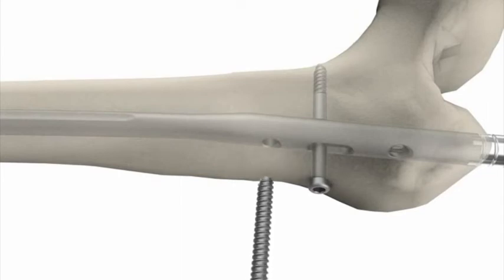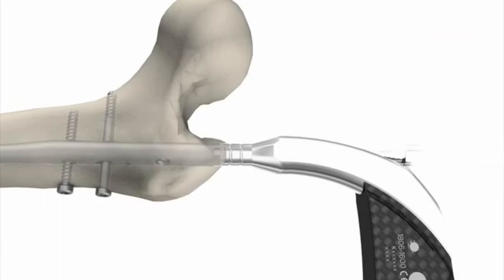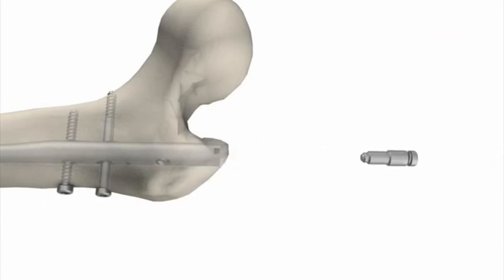Leave the screwdriver in place while inserting the second locking screw into the static hole. Note that the oblique locking hole may not be used with the cannulated compression screw.